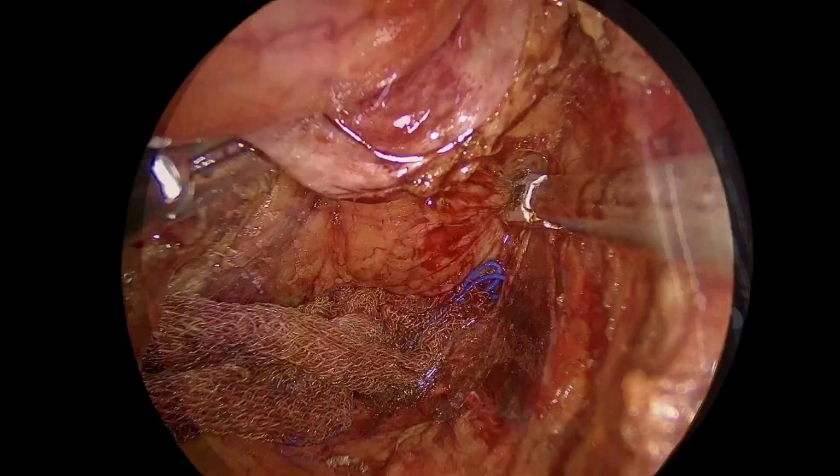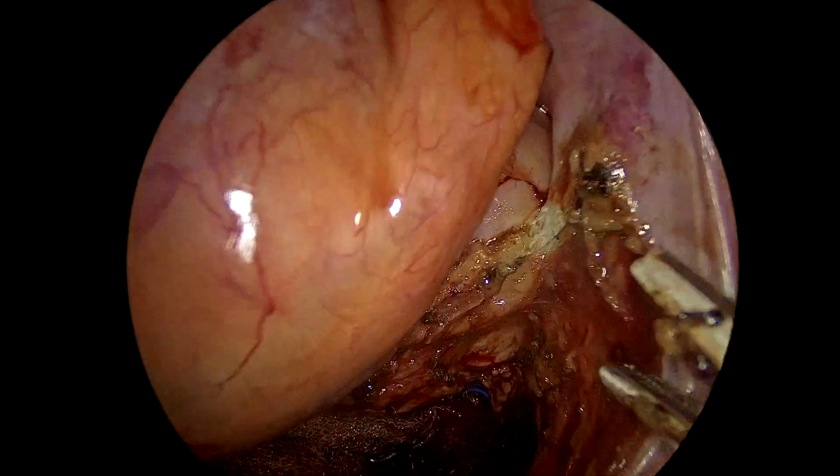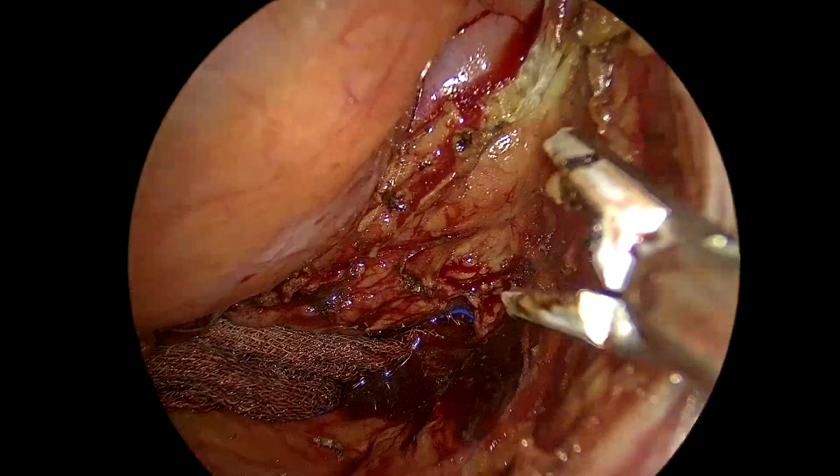You must retract the rectum medially to find the correct plane to preserve the pelvic plexus nerve and ureter.